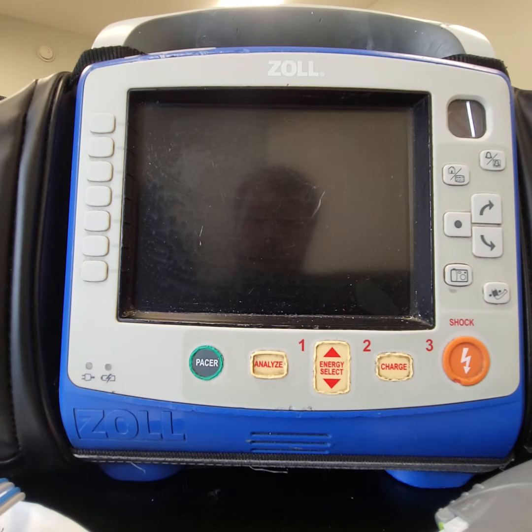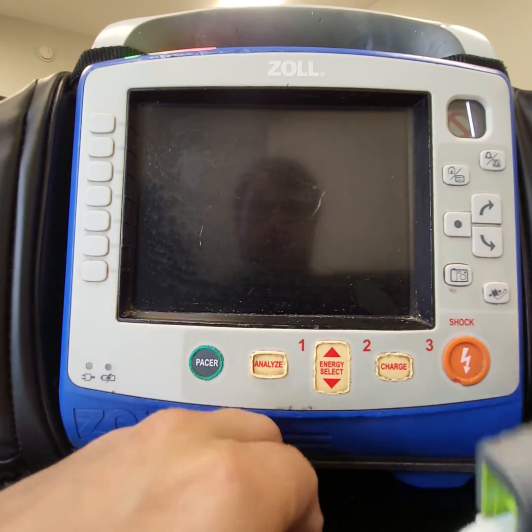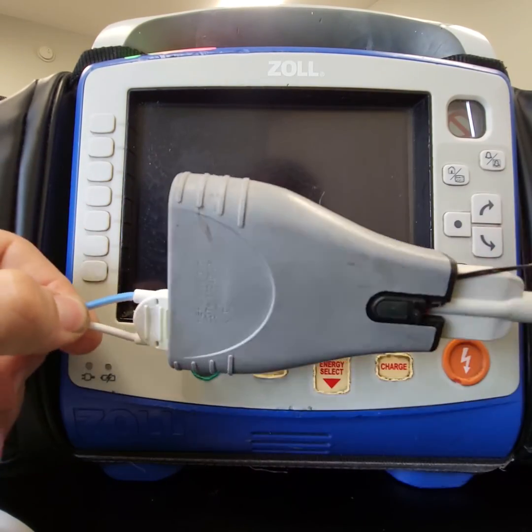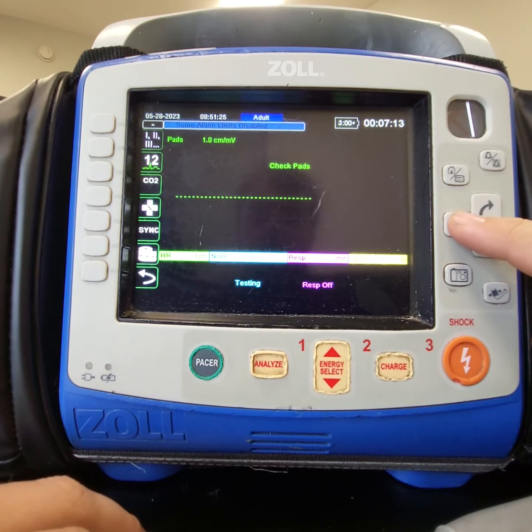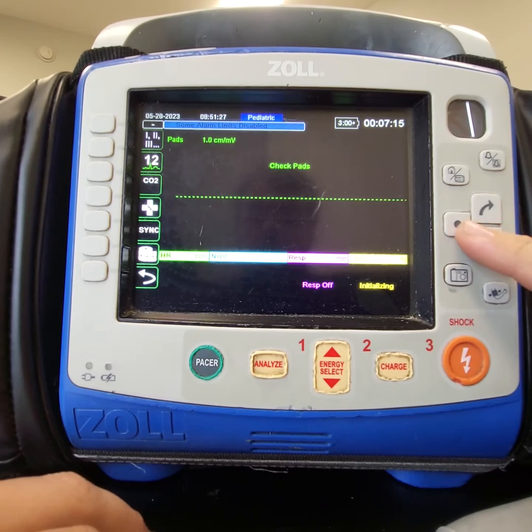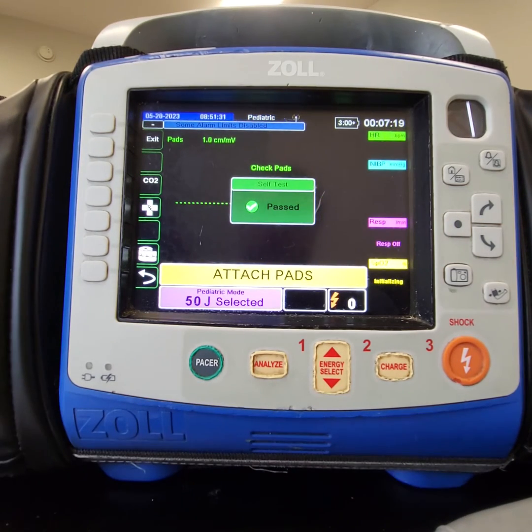So just to review: if you need to defibrillate a child or infant, start your monitor, have your pads connected either with the adapter or without it. When the monitor starts, switch to pediatric mode, hit analyze, attach pads, and you'll be in the correct mode.